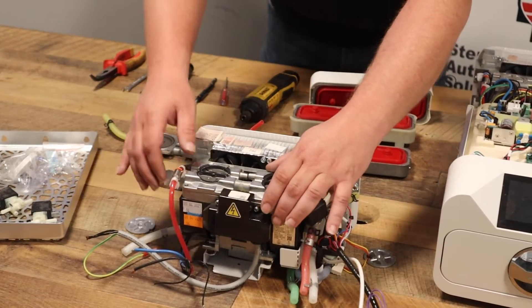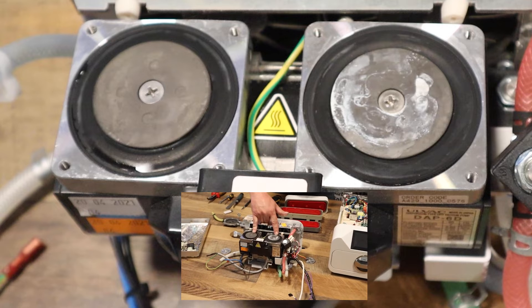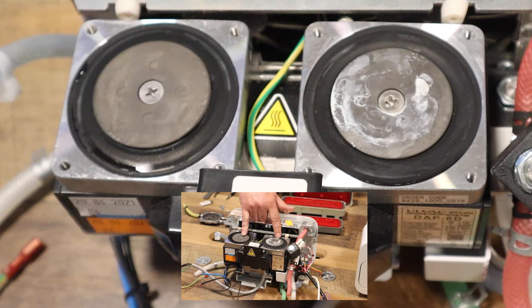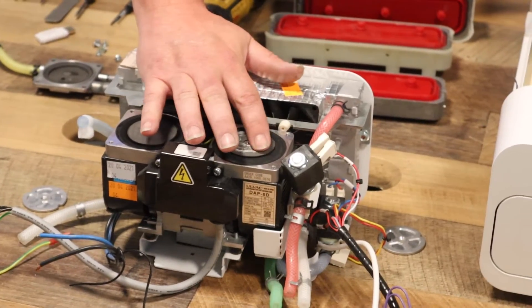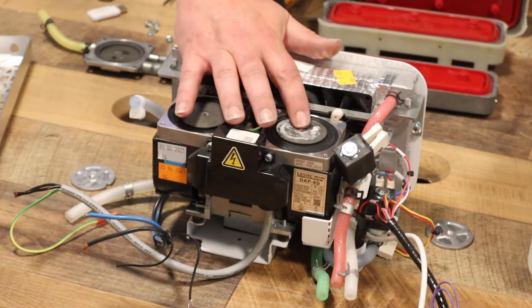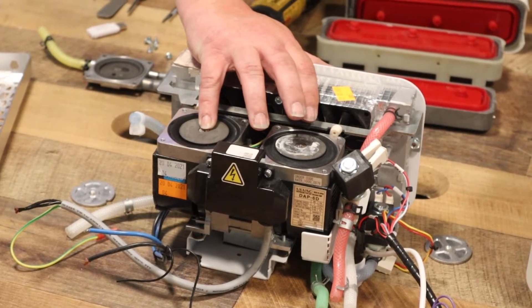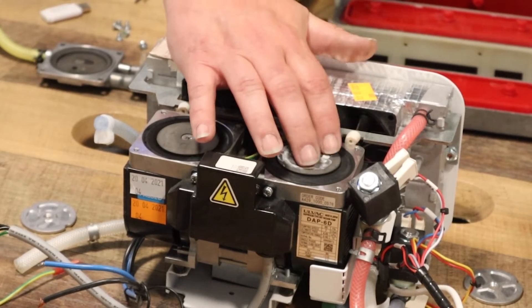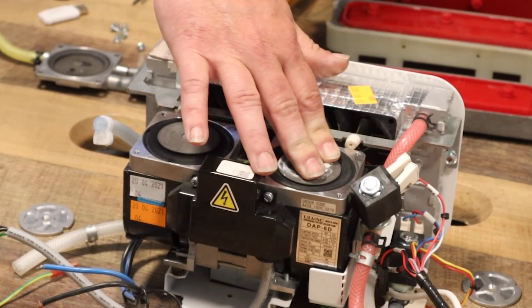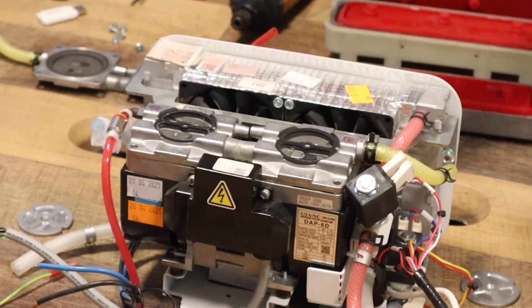Once you change those heads, you have two membranes here that are part of the kit that you have to replace. They do have lock points with these plates. Your kit includes new membranes and new plates, not new screws — so be careful not to strip them out when trying to remove. When you put them in, you have to lock it in place, hold it down with your hand, and make sure it's locked down in place before aligning your screws. If you don't do that and you go to run a vacuum, it will not run.